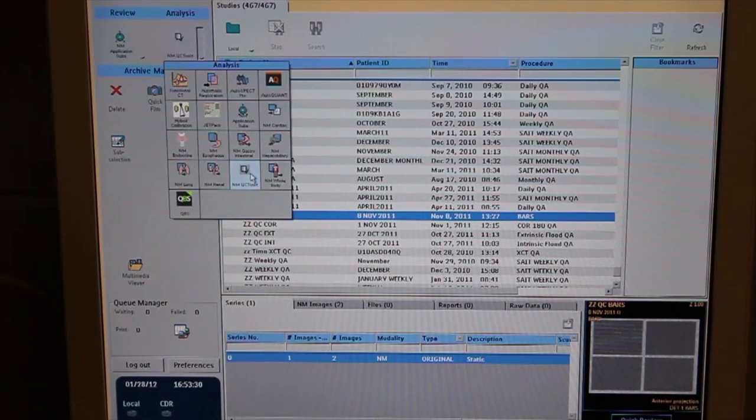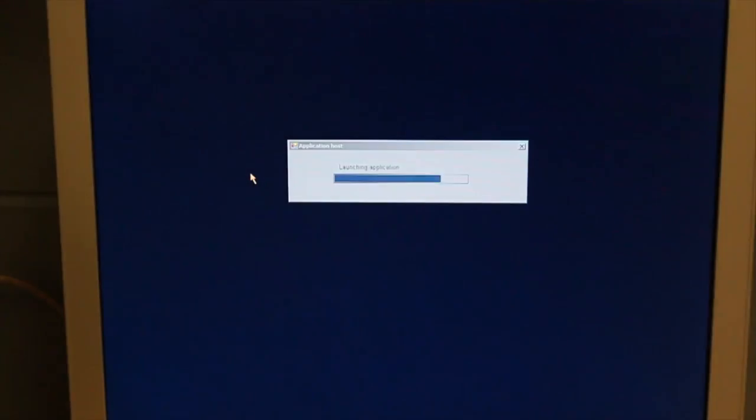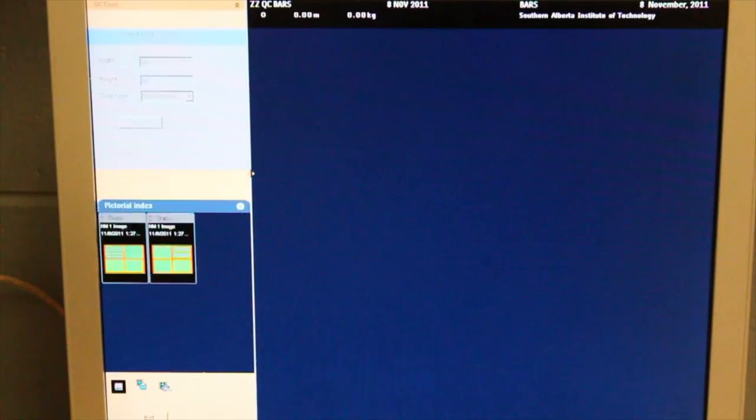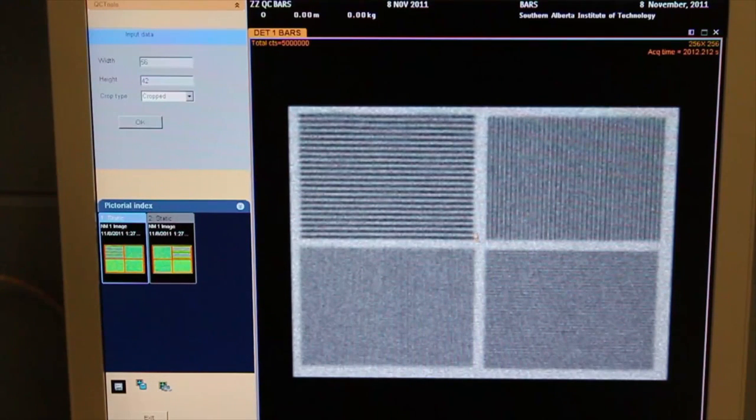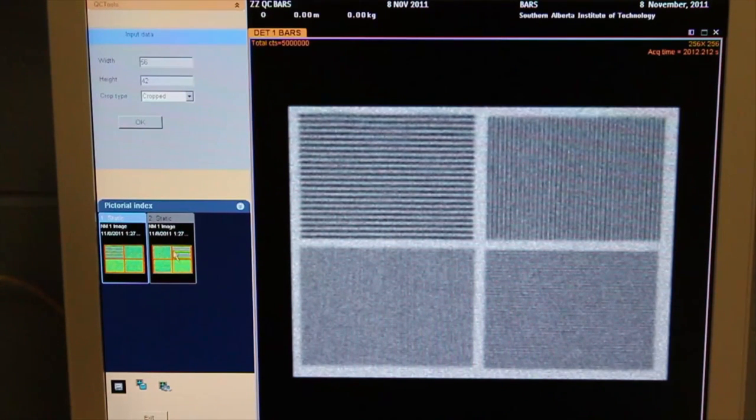The analysis for this test is done qualitatively only. Enter the QC tools from the analysis menu. Select detector one, display the image. Identify the quadrants and the degree of visualization of the bars. And repeat the same for detector two. These images would be compared to previous and saved on a disk on a weekly basis.